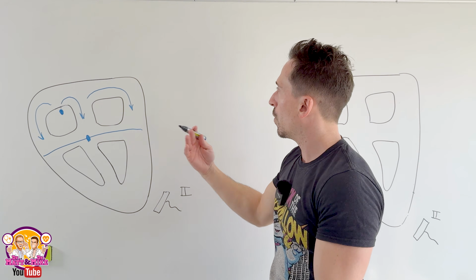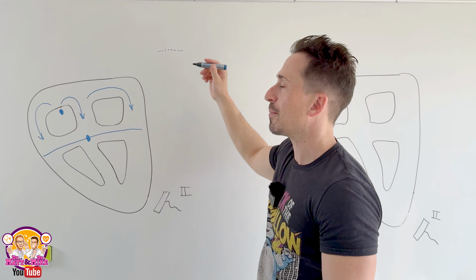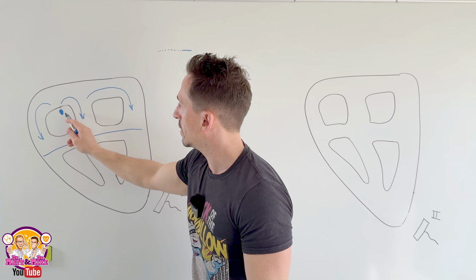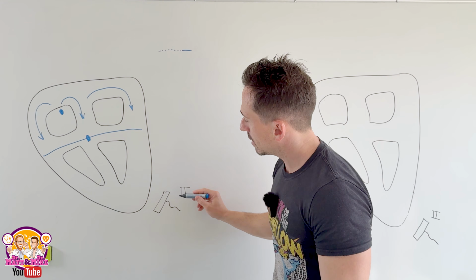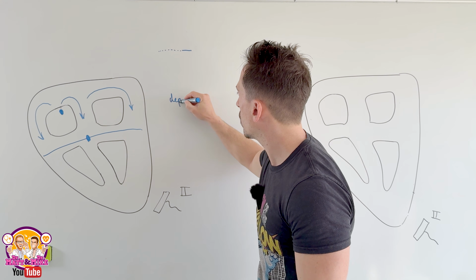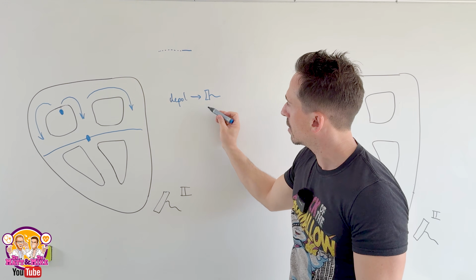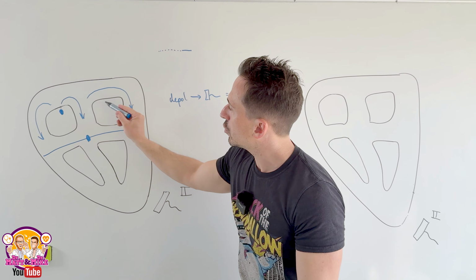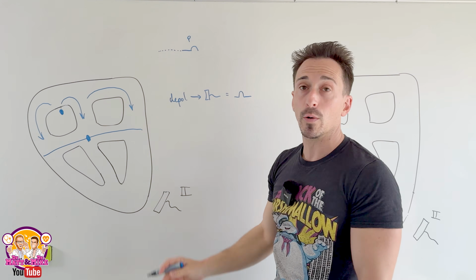That's important because when we do an ECG, first of all, we've got our baseline, right? Nothing's happening. And then the SA node spontaneously depolarizes, and the depolarization event occurs in that direction. Now that direction is happening in the direction of the lead. And there's a cheat sheet: if you have depolarization happening in the direction of the lead, you get a bump up on your ECG trace. So when the atria depolarize, we get a bump up on the ECG trace, which we call the P wave.